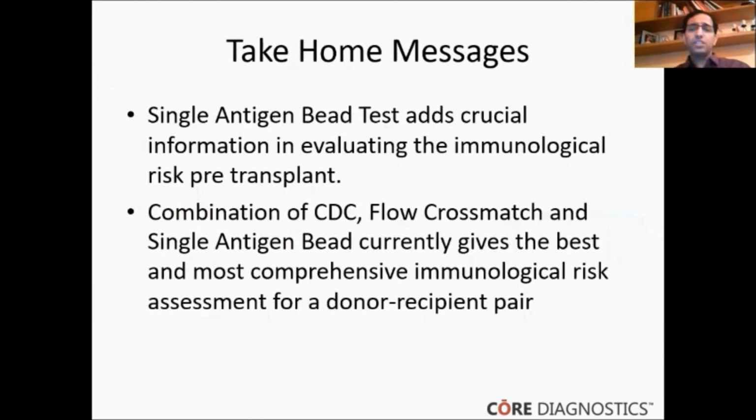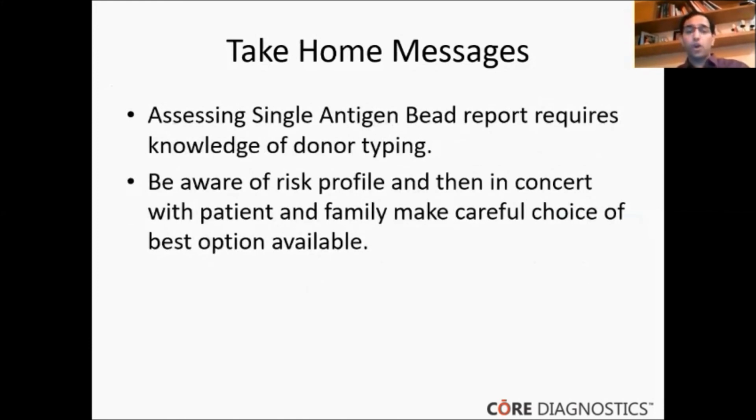So take-home messages: single antigen bead test adds crucial information in evaluating the immunological risk pre-transplant. A combination of CDC, flow, and single antigen bead currently, in my mind, gives the best and most comprehensive immunological risk assessment for a donor-recipient pair. Assessing the single antigen bead report requires knowledge of the donor typing to know whether they are donor specific or not. Be aware of the risk profile, and then in concert with the patient and family, make a careful choice of what the best option available is.